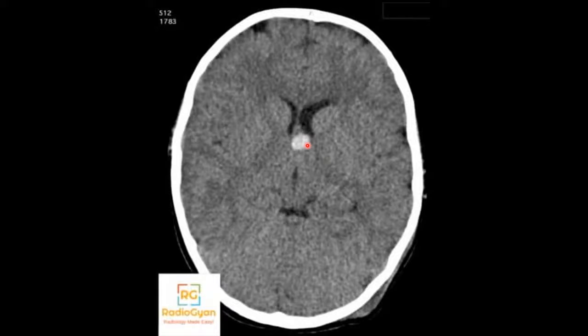Usually, it's an incidental benign finding, but what is one complication that you have to report? Whenever you see a colloid cyst, you don't stop there. You have to say that there is no hydrocephalus. Right. So we have to mention if there is any hydrocephalus. So it can cause hydrocephalus, and usually these patients will present with acute onset of headache. But mostly what we commonly see, these are incidental findings.